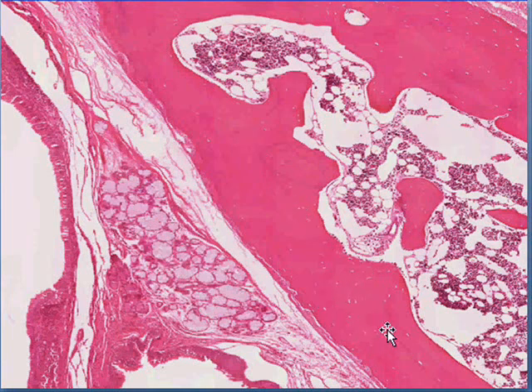You could see osteocytes living in the lacunae here. You could see osteoblasts along the edge of the spicule, and you could see marrow and fat, various types of marrow cells. You can also see that there's some type of lining here, perhaps the wall of the cyst.